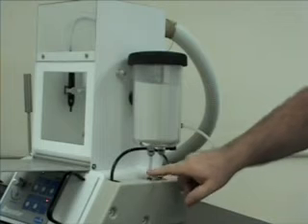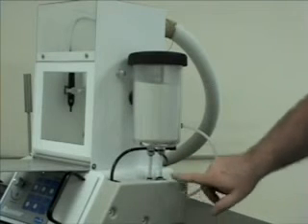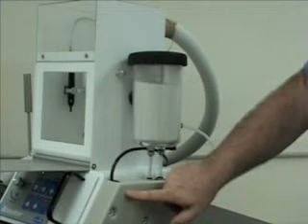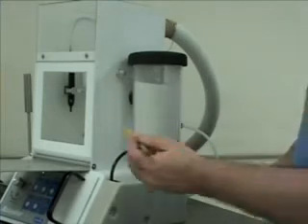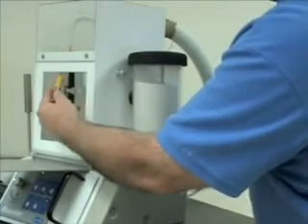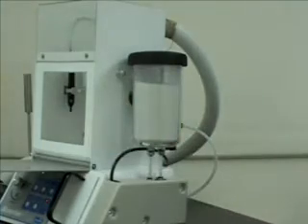Okay. The beads rejoin the airstream, which comes across here as well as going up here. They rejoin the airstream and get injected in there, so now you've got beads moving very quickly, and they go through this tubing and around through the back of the unit, and then they come back into the unit through this hose up here, down through the wand, finally into the tip, and out into the investment mold.